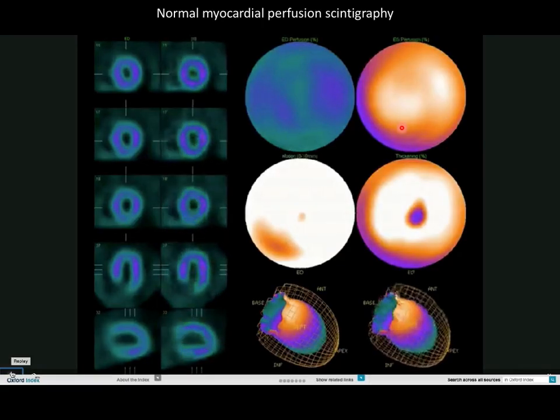And so here, when you play back, if you parse up the data such that it's in different time frames during the R to R, you can see an estimate of the myocardial function, right? Because you see that the muscle in a short axis view is contracting towards the center. And then this is a 3D mock-up of that signal, right? And so that looks normal. That's what a normal one looks like.